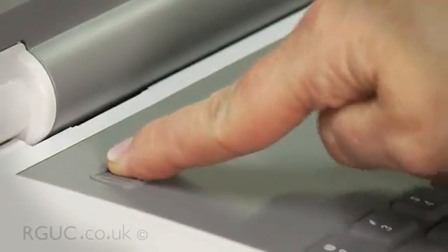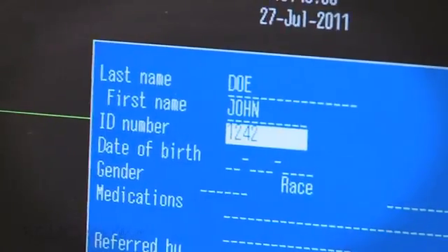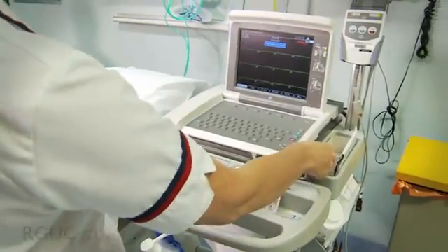Enter the patient details into the ECG machine. If the ECG machine does not allow you to enter the patient details into it, then you must write the patient's details on the trace when it's printed. Remove the disposable electrode tabs from their packet and place them on the ECG trolley, along with an abrasive preparation pad, the alcohol-based cleansing wipe, and a razor if required.